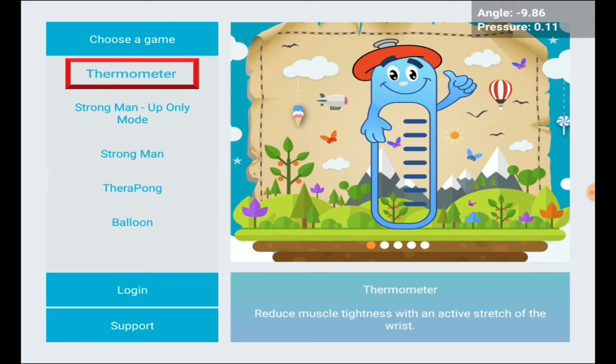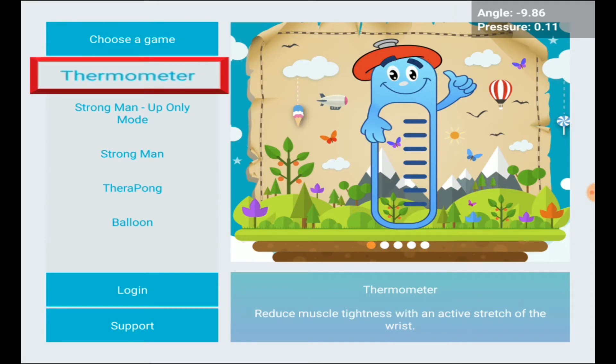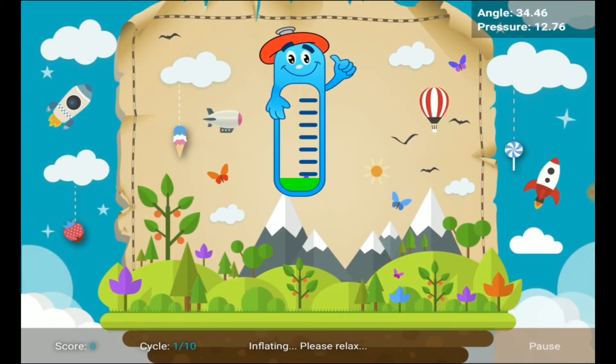The first game is the thermometer game. Enter it by clicking on thermometer as the first item on the menu. The device will pump up and inflate to a stretched position — this is a stretching exercise. Your goal is to stay as relaxed as possible; as you relax, the green indicator will move from red to orange to yellow to green. The more you relax, the lower it will go. Each stretch cycle lasts 30 seconds with about five seconds of rest in between.